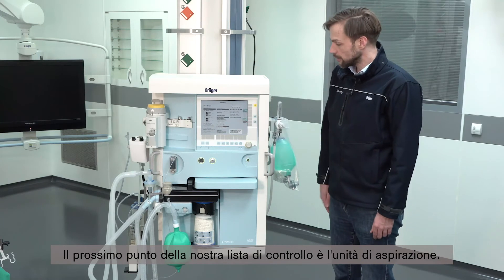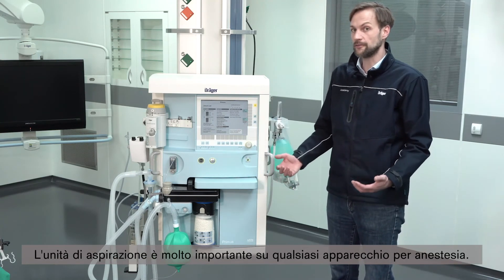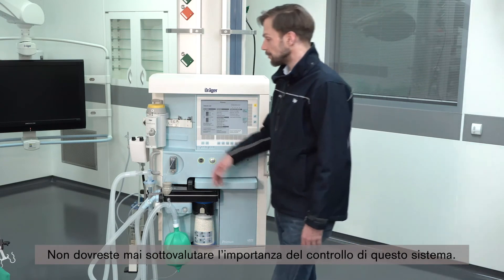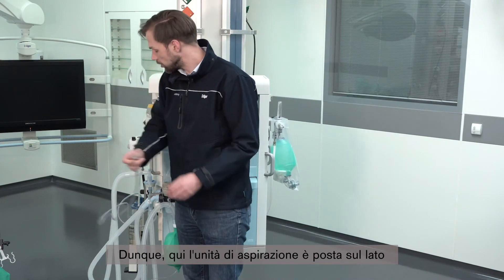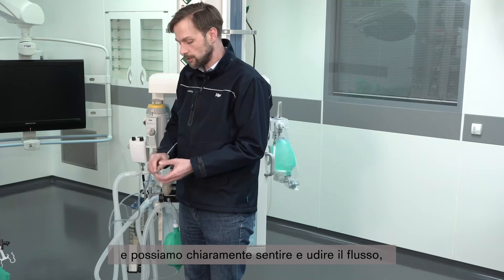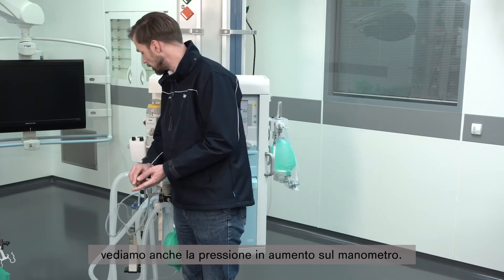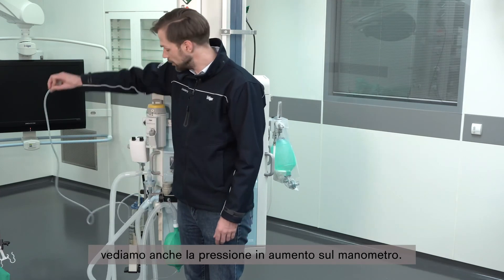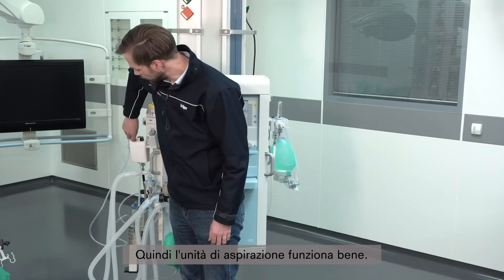Next on the checklist is the suction unit. The suction unit is very important on any anesthesia device, so you should never underestimate checking this system. Here we have our suction unit on the side. We can clearly hear and feel the flow, and when we close the system we also see the rising pressure on the manometer, confirming the suction unit is working fine.